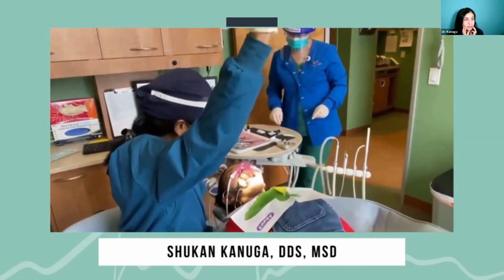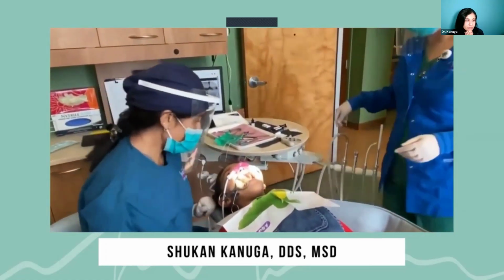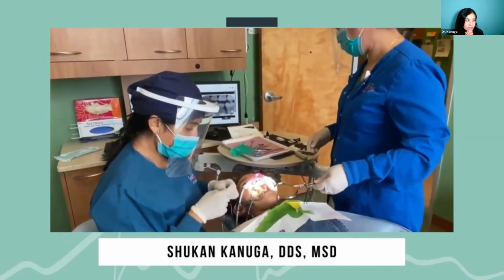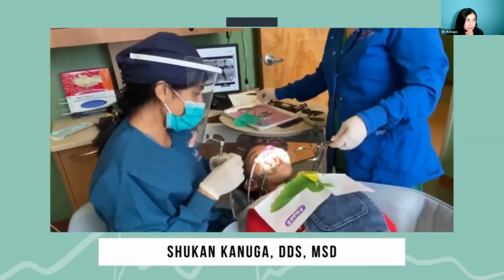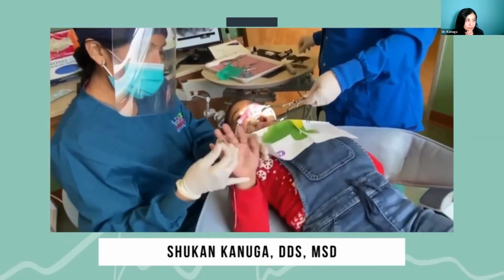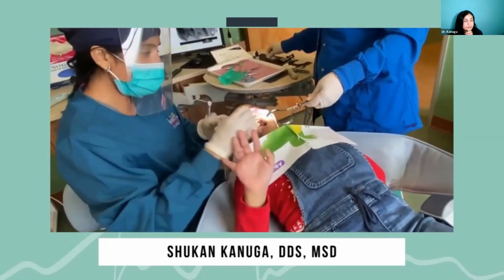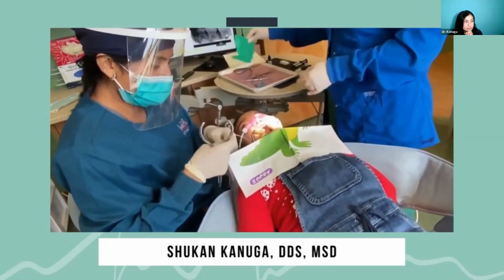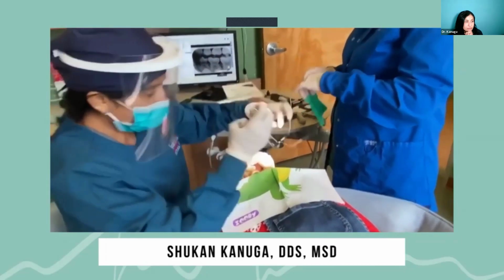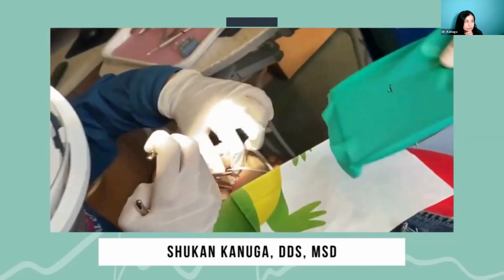So next, sweetheart, we're gonna put a raincoat so that you don't swallow any yucky sugar bugs, you don't taste anything. And then this pillow is gonna help you stay open, okay? The raincoat stays in place with the ring. It's just like a finger ring. Give me a finger. There you go. So it's gonna give your tooth a little hug, just like you hug your little brother, okay? So you tell me if it's not tight. I can always make it a little tighter. Okay, perfect. That's my ring.